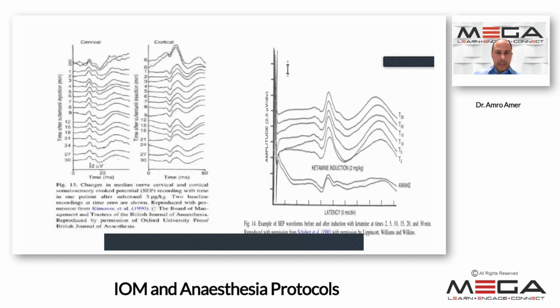Here is another one showing the different effects of drugs. On the right, ketamine. The baseline is at the bottom. The more you go with ketamine induction, you see the signals higher.